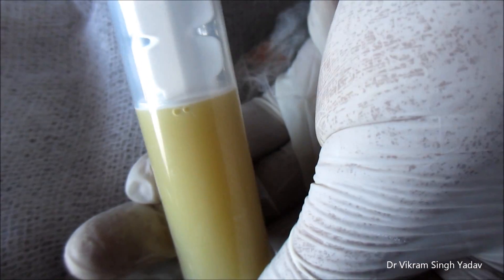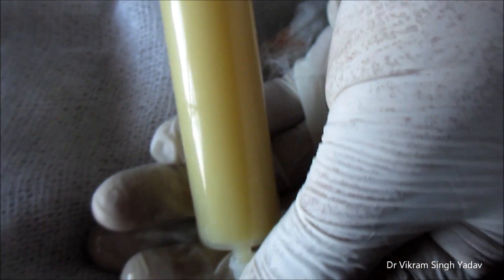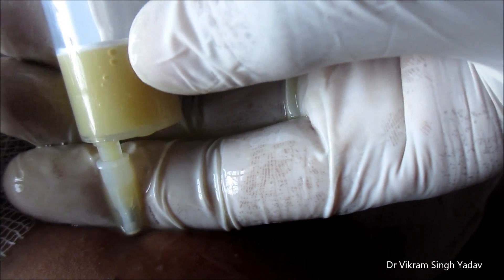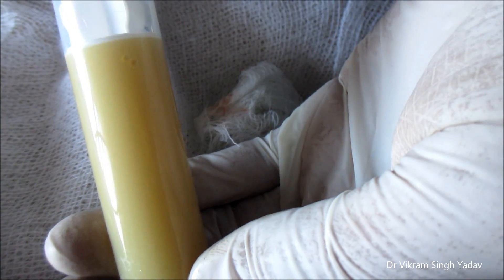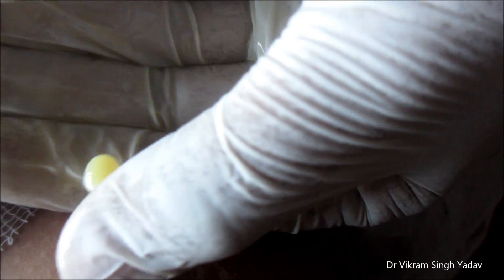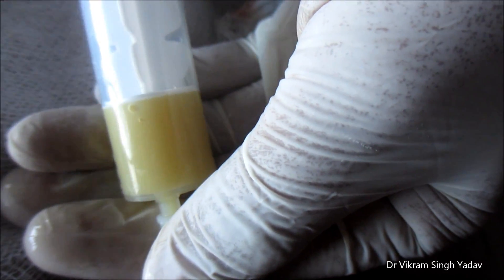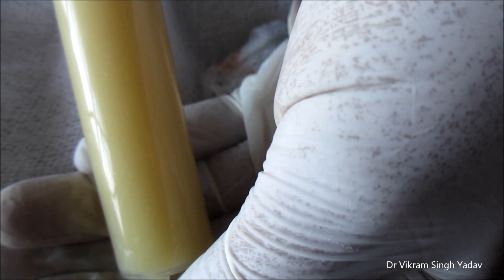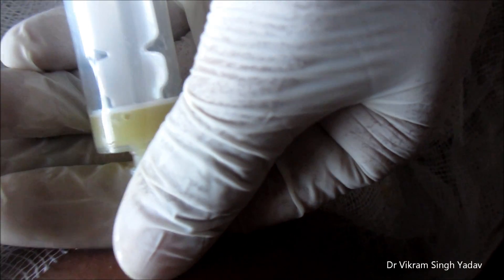The pus collected must be sent for culture and sensitivity, and after that a proper antibiotic therapy should be given. Since it is tuberculosis, anti-tuberculosis therapy should be prescribed as well. About 300 ml of pus was aspirated out of the huge cavity formed over there.